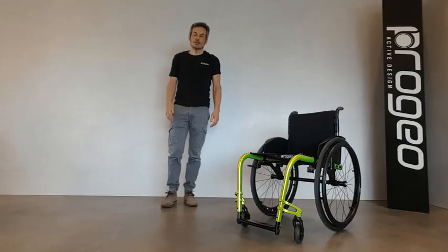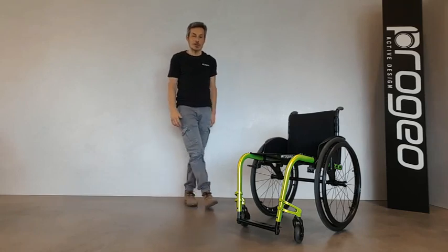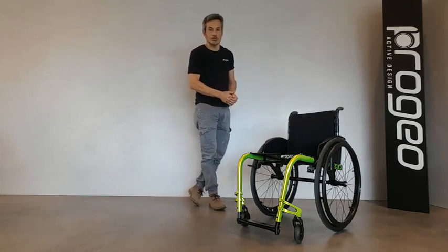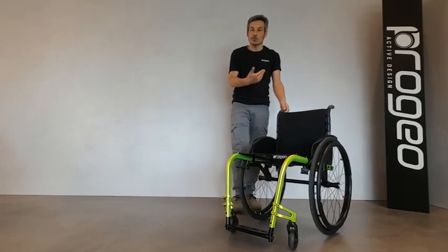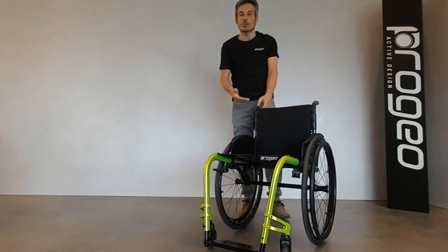Hello everyone, I'm Francesco Barbone, product specialist at Progeo. Today I'm going to show you the ultralight active wheelchair Joker — a rigid frame model that never stops amazing.